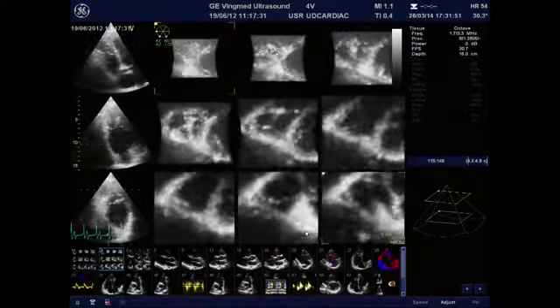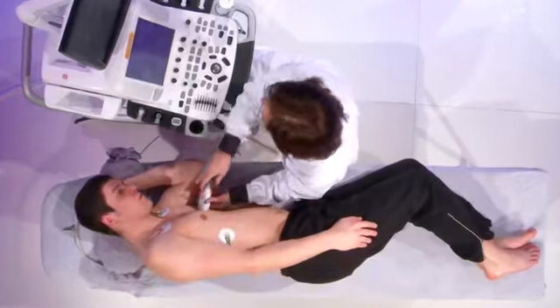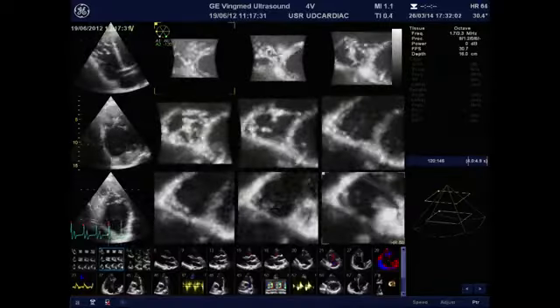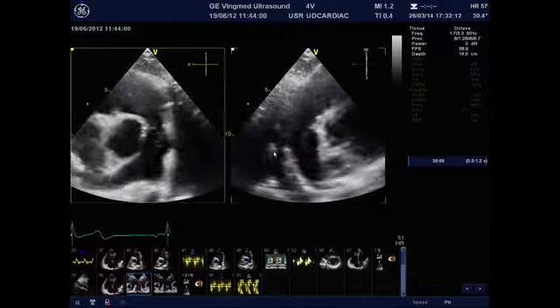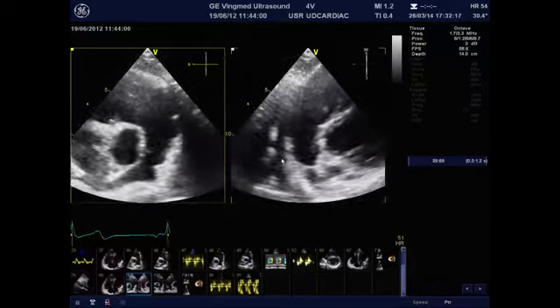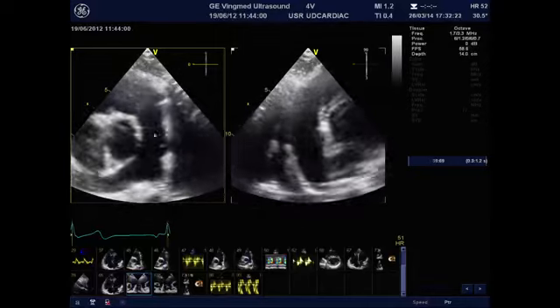And we can go now to look at the pulmonary valve from the parasternal approach. And keep in mind the fact that the 3D probe can be used also for biplane imaging, not only for 3D rendering. So you can have a very quick appreciation of the morphology of the pulmonary valve in two perpendicular views side by side, and here you can see very nicely the lack of coaptation, and this is confirmative of the mechanism of the pulmonary regurgitation, which is organic in this case.